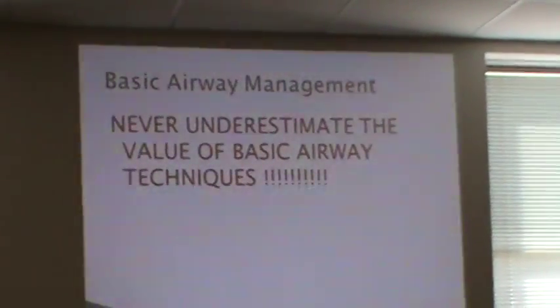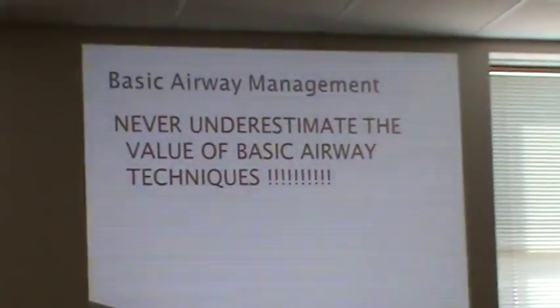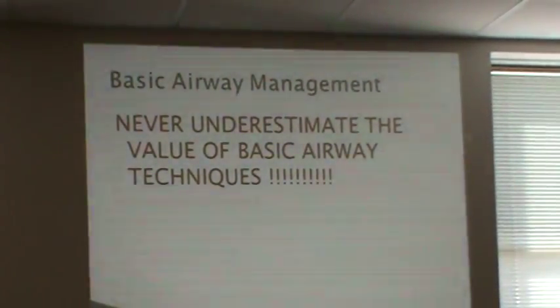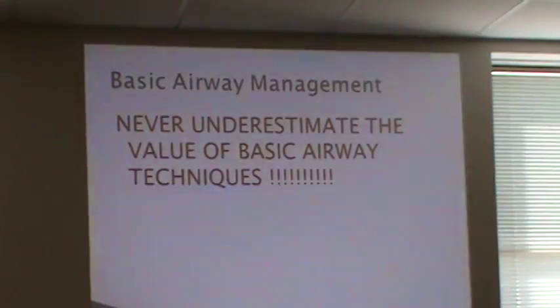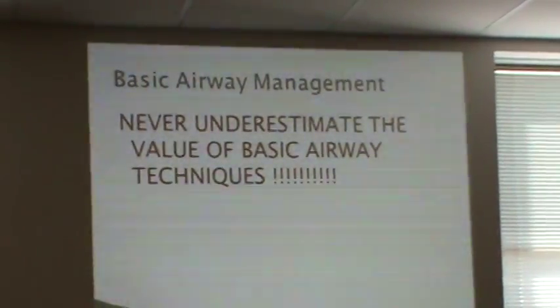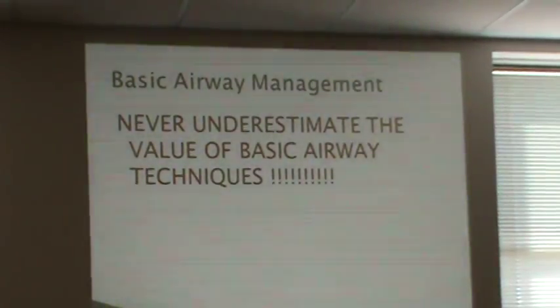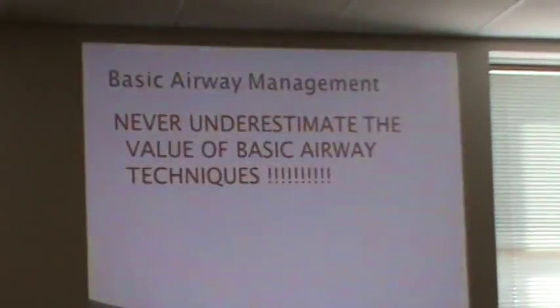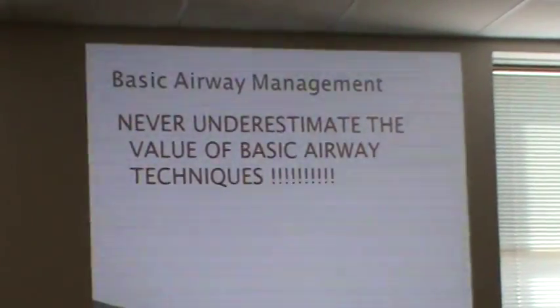All right. Well, one of the most important things that I want you to get out of this lecture is never underestimate the value of basic airway techniques. Most airways are manageable with basic airway techniques, and it'll buy you that time for an advanced airway, and it's always the bailout plan if your advanced airway does not work out.